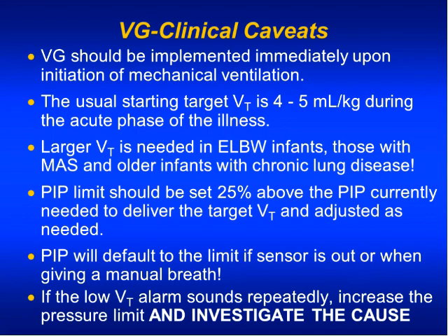Babies with different pathophysiology, like meconium aspiration or chronic lung disease, who have increased alveolar dead space, air trapping, and overexpansion, also need larger tidal volumes to achieve the same CO2. Then you have to set your pressure limit so that the machine can adjust the working pressure both up and down. And we need to keep it, roughly, in that relationship, because it's among the other benefits of volume-targeted ventilation.